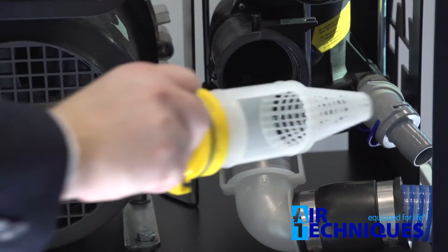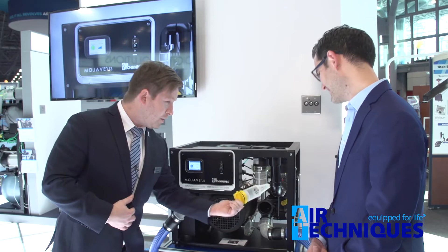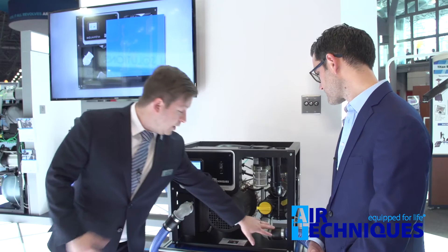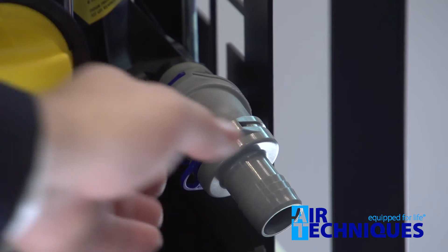There's a coarse strainer right here just to make sure that any debris that happens to get through — like a patient's wedding ring — gets caught before it goes to the pump. That's really easy to access. All the hose connections are rotatable for easy installation. This is a standard one-and-a-half inch exhaust, going down to a one-inch connection for the trunk line and a one-inch drain.